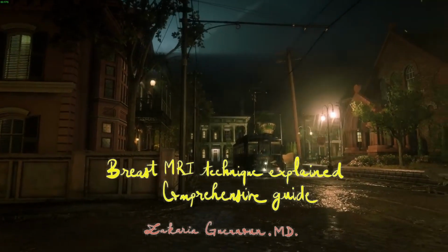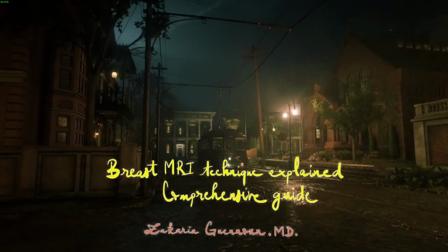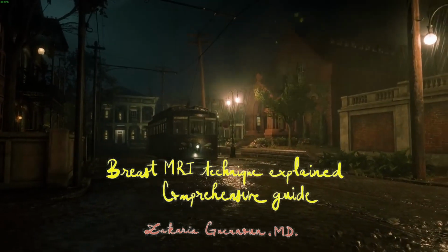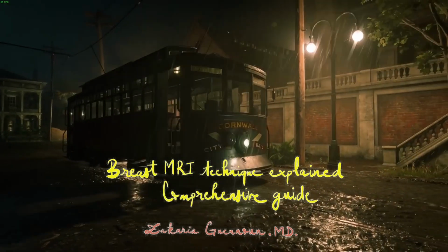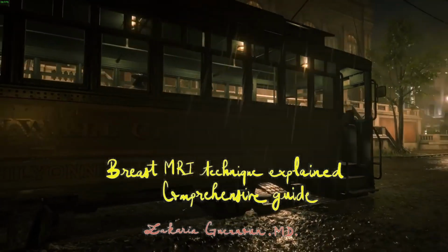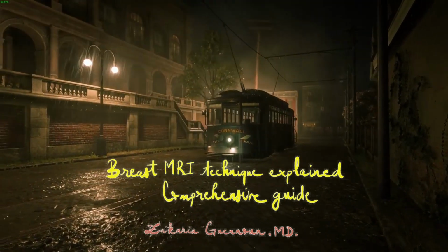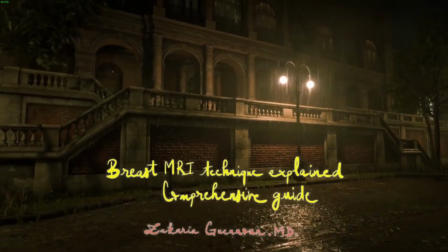So to come back to kinetics, why is it so important? Because during the evolution of an infiltrative mass in the breast, there is development of angiogenesis, which will help the tumor grow. And these new vessels are abnormal, with porous leaky walls, in such a manner that if you inject contrast into the body, the uptake of contrast by the tumor, corresponding to its enhancement, will result in an ascending kinetic curve, but then the leaky walls of the angiogenic tumor will result in a leakage of the contrast and washout, corresponding to a descending kinetic curve.